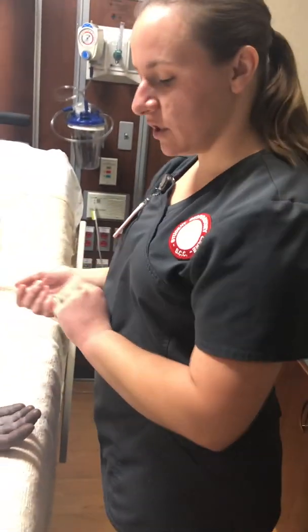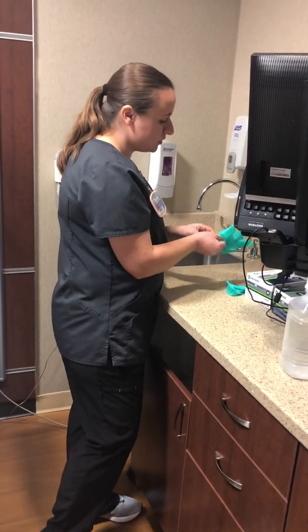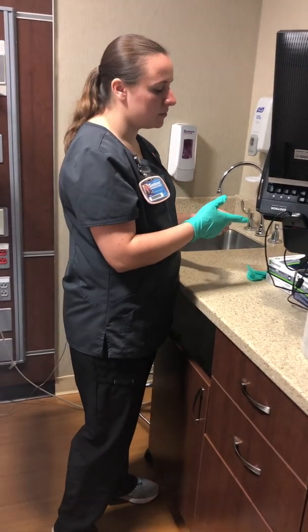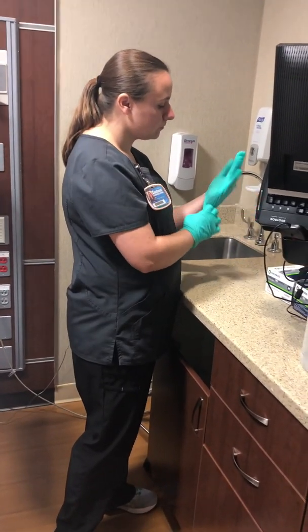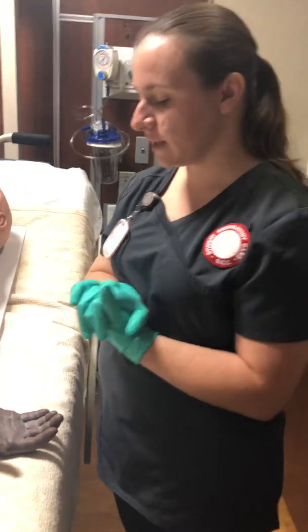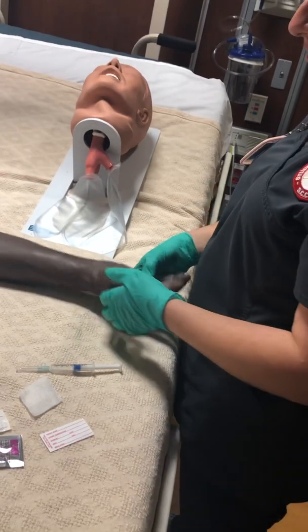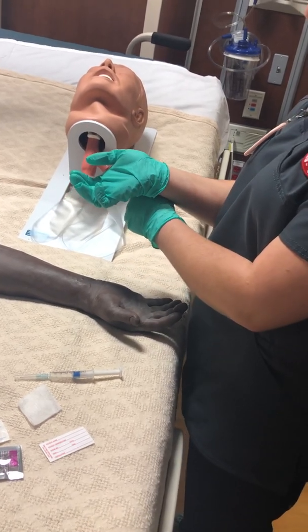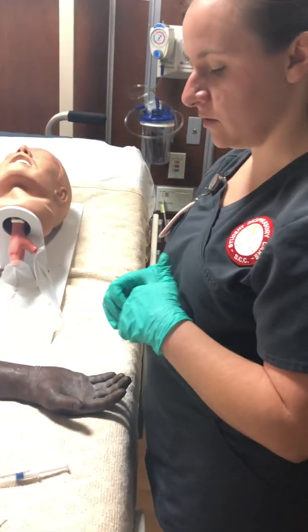Before I touch the patient, I always need to wash my hands again, and then apply the appropriate PPE. Sometimes if I feel like they're kind of shaky, I feel better if I wear a mask, just in case something happens. I'm always going to wear gloves when I do a blood draw, because you don't know if they may have something that you don't want to get on your skin. First, I make sure there's something underneath the patient's arm. It needs to be extended out like this, with a towel or paper towel roll underneath, to make it a little easier for me to get the blood draw.